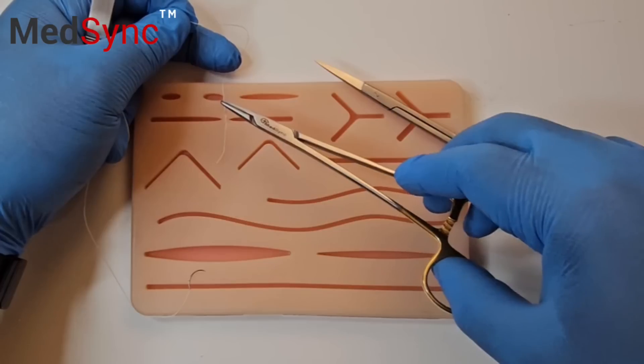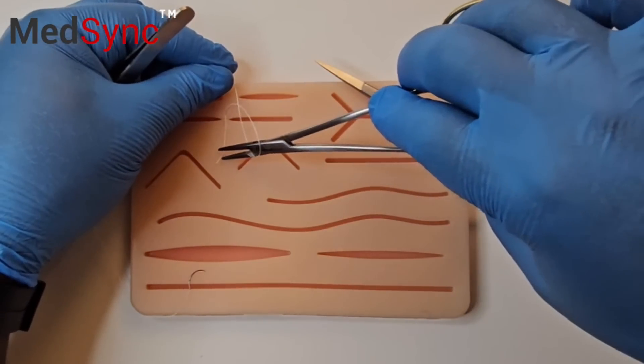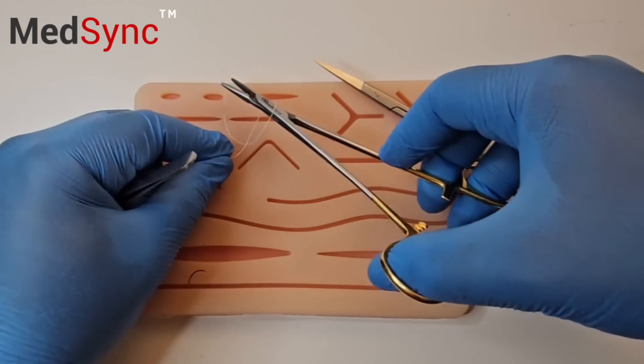You then need to perform two single revolutions around the needle holder — a reef knot. The suture ends must alternate.